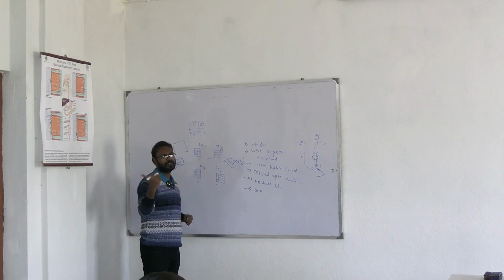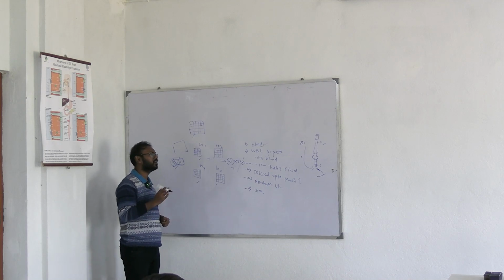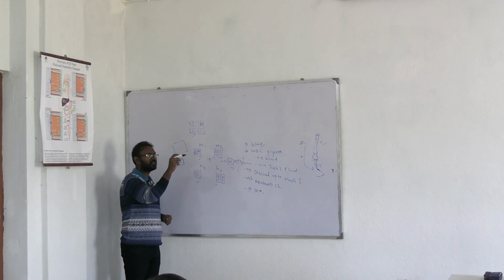Already on the previous day you have handled the microscope and you have seen the squares and all, where to see the WBC, how to calculate them, the dilution factor, and also the calculation which ultimately comes into 50N. What the Neubauer Chamber is and what its dimensions are, we have all discussed on the previous day.